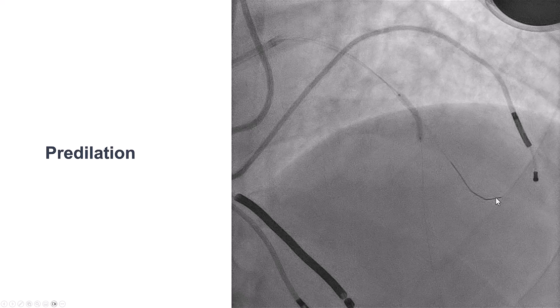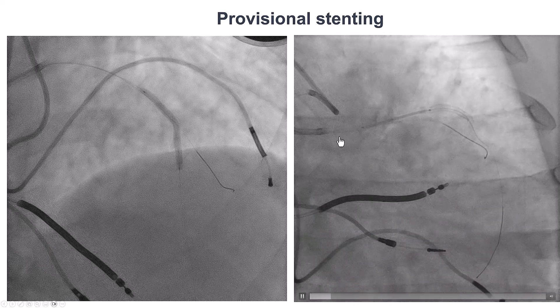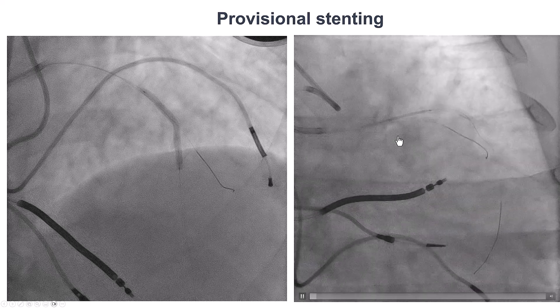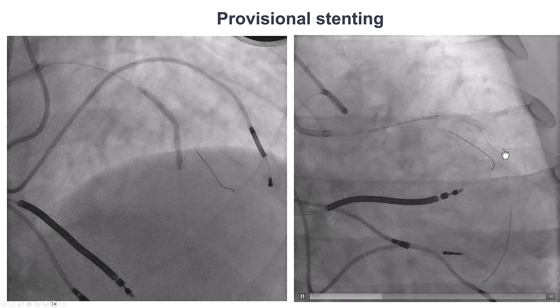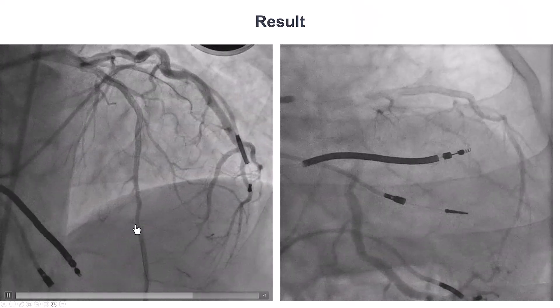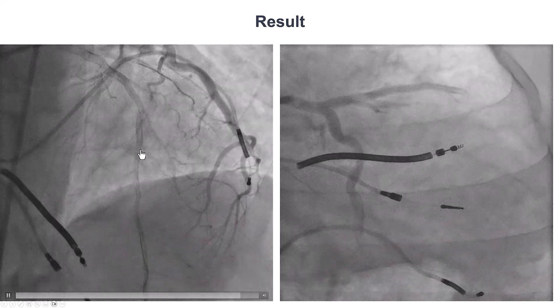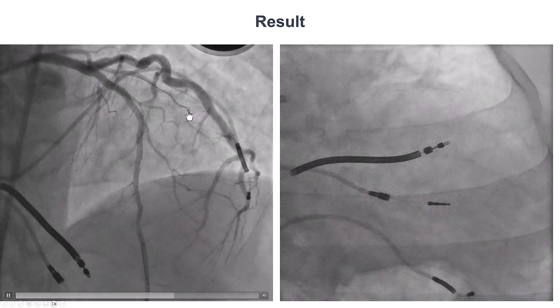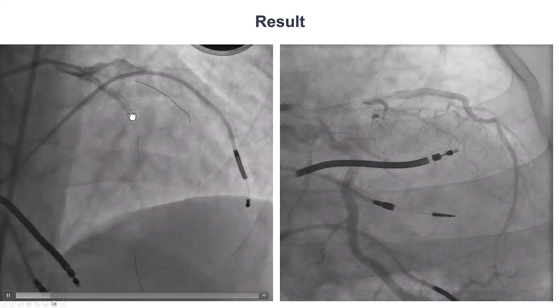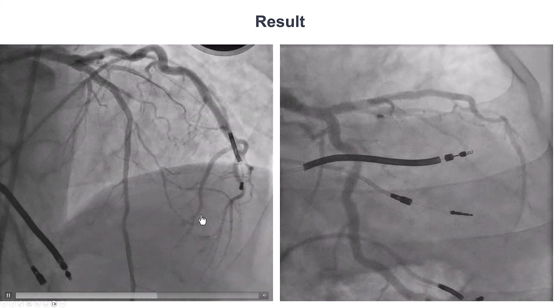We predilated, leaving the guide wire in the side branch for protection. There is good expansion, which we expected based on the lack of calcium seen on intravascular ultrasound. Then with provisional stenting, we advanced two stents into the mid and proximal LAD, jailing both diagonal branches. After proximal optimization, this is the final result — excellent flow to the LAD. We can see the LAD has already grown in size compared to before recanalization, and we have patency of the diagonal branches at both the proximal and distal caps. That distal diagonal is a fairly large vessel.